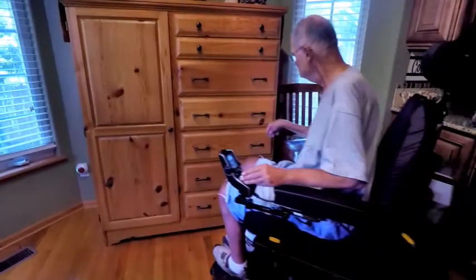A little thought might be required before just arbitrarily deciding that a joystick controller should be at the location of your dominant hand. Give it some serious thought. Manufacturers offer a joystick position on the left side or the right side at no extra cost. So your question might be, where should the joystick controller be mounted, on the right side or on the left side? Some people might say, I'm right-handed, therefore the joystick should be on the right side. There is an alternate view on that.